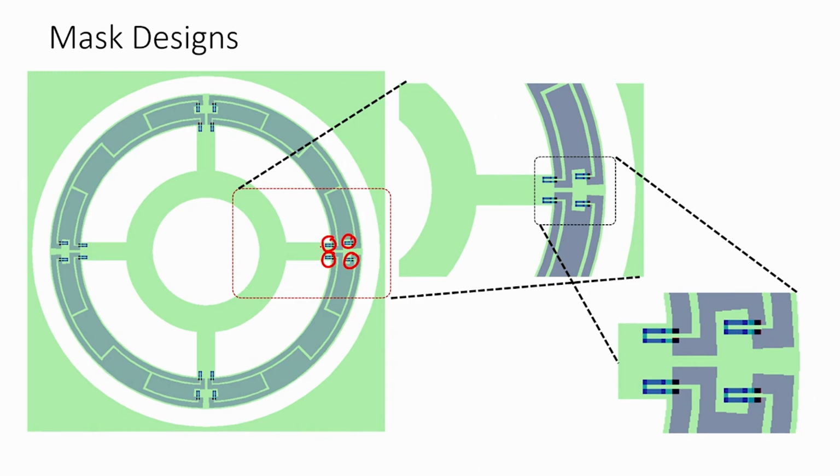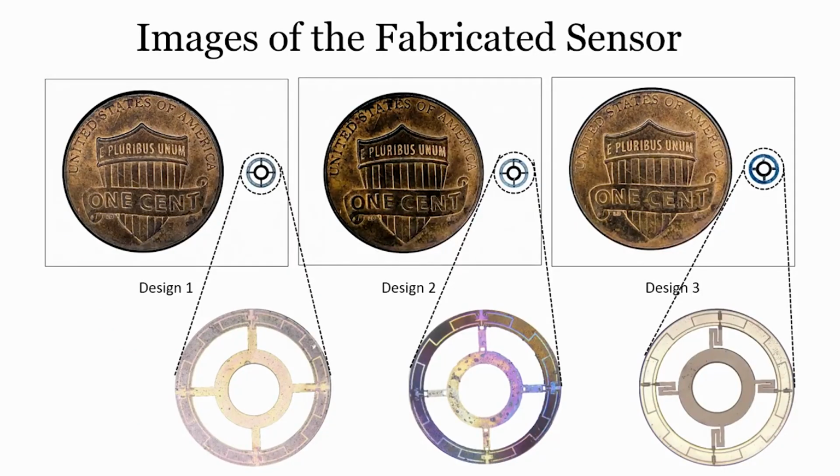If I have a magnified version of that, then you can see very clearly the strain gauges, which are 4 in number here. So, two will balance out the other two, and we can use the circuit with a Wheatstone bridge. We have tried different designs, and these are actually the fabricated sensors with us, right. One is directly with no hole in the bridge, the second one has two holes, and the third one is with the serpentine structure, right. So, this is how the sensor looks like.